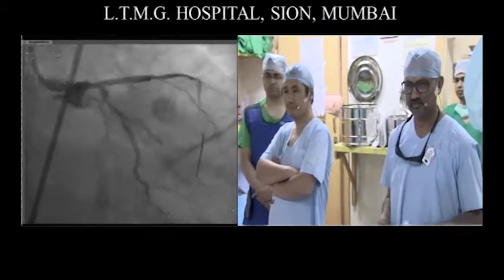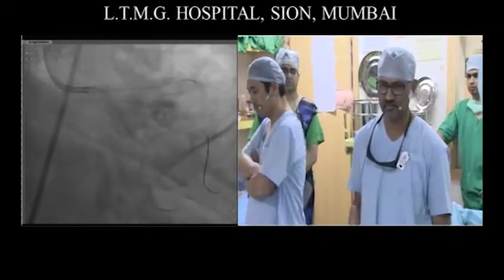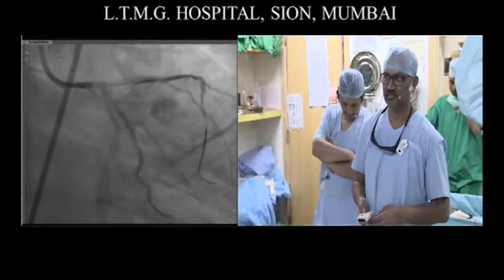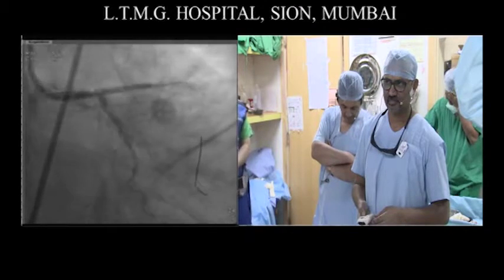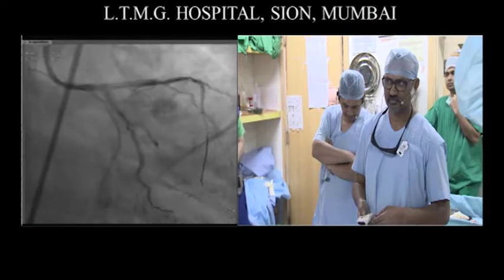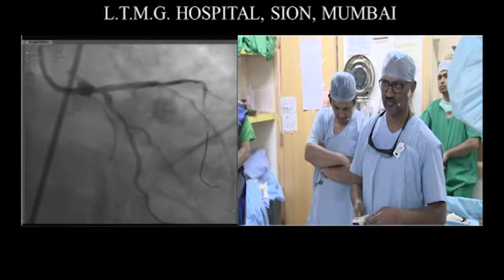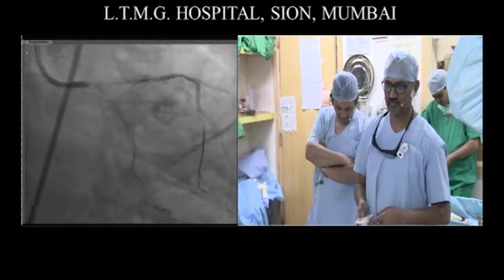I think it looks good. If there are no other comments, we will move on. Any other comments from the panel? Dr. Fitzgerald, anything else? No, I think that is good. This patient is going to have difficulty if there's restenosis for whatever reason. Surgical option is probably not going to be possible. So I think it's important that this patient be followed closely, but I'm hoping there's not going to be in-stent restenosis because you've got a full metal jacket there. It's good for now, though.